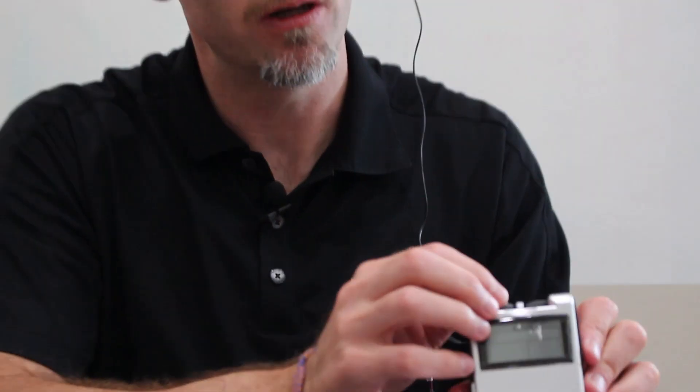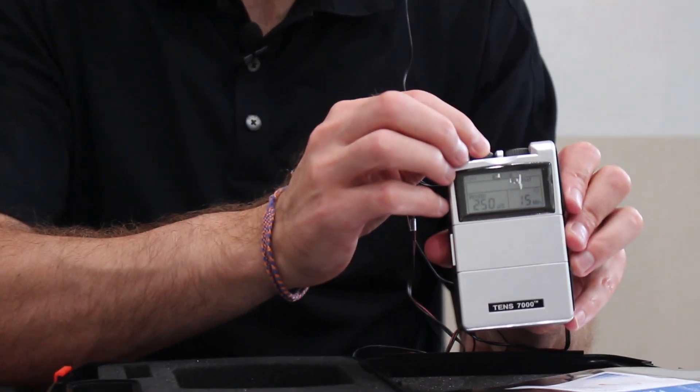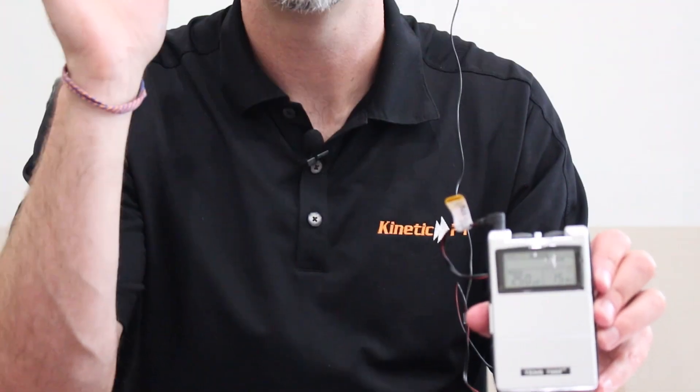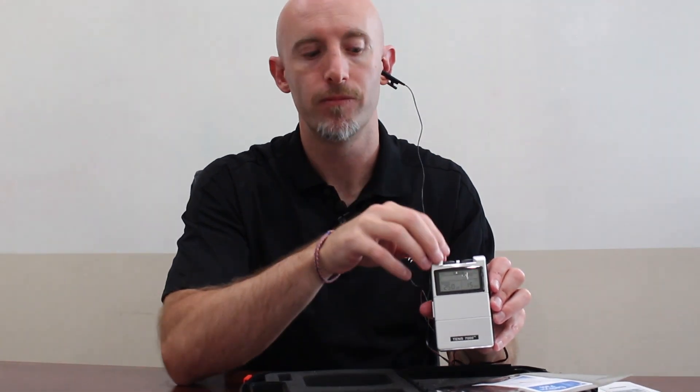Open it up and slowly turn it on — it clicks and beeps. Slowly turn it up, and already I'm starting to hear a tap, tap, tap, tap — then you're done. You don't want to go too high because it's not supposed to be uncomfortable. What we're doing is activating the vagus nerve so it calms the nervous system.